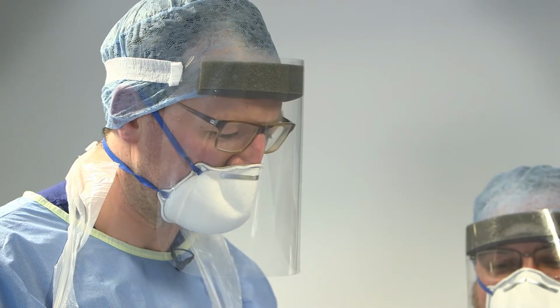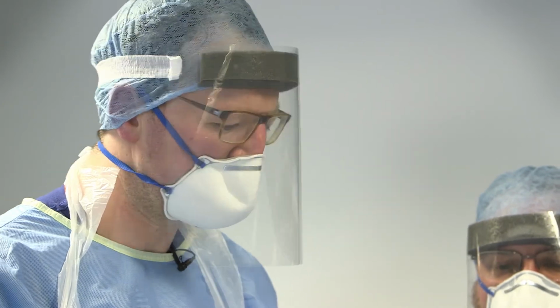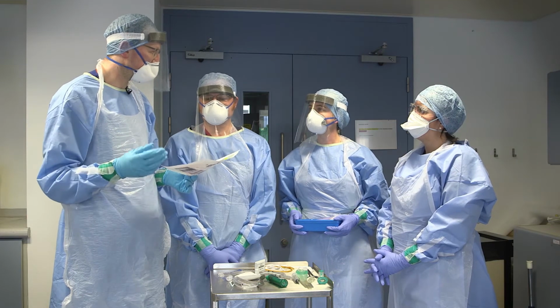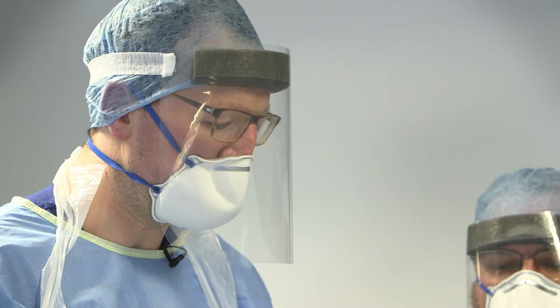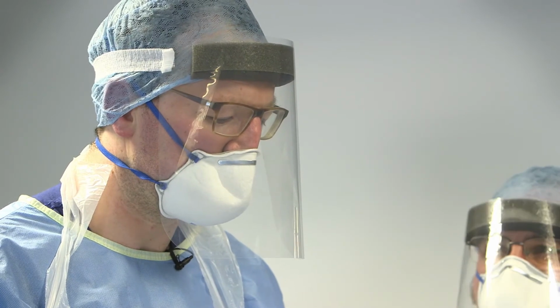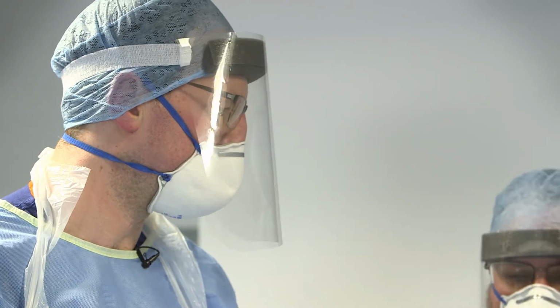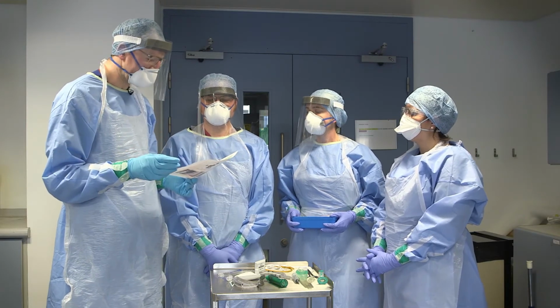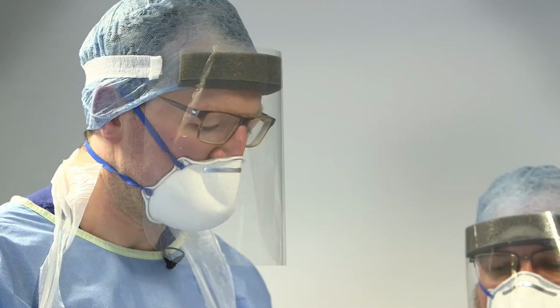Okay, so we're going to move on to the airway plan. So we're going to give the induction agent and rocuronium together, Tori. And I will be holding the face mask on as pre-oxygenation, and I'll be avoiding face mask ventilation during that time. Plan A will be a tracheal intubation with a video laryngoscope, and I'm going to use a bougie. I'll have a maximum of 3 attempts, and if failing, I'll declare a failed intubation, at which point, Trevor, if you could communicate to Laura outside of the room to access the front of neck access pack and to bring that into the room.